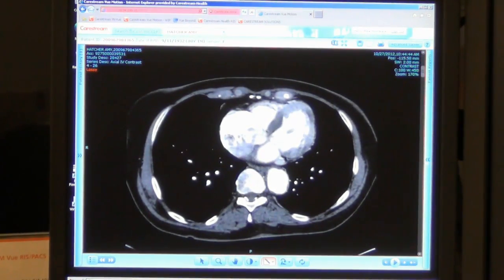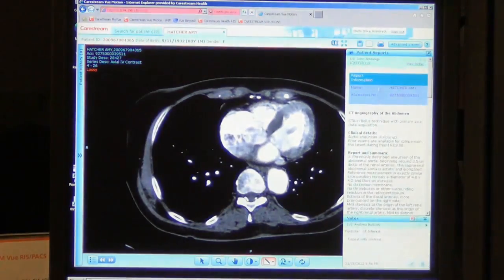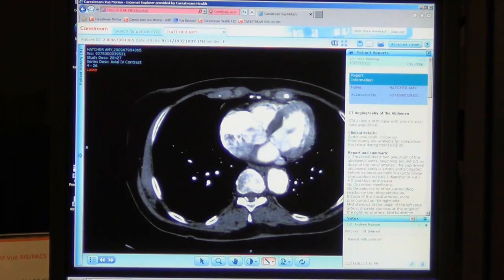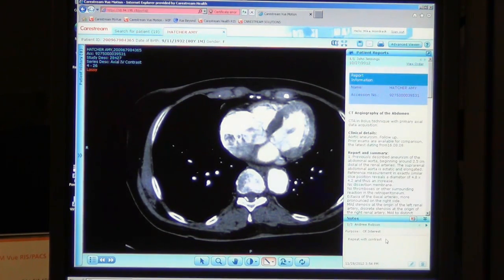To the right of my screen, I can pop out a panel that displays a text version of the report, along with any notes from the radiologist, which may include critical values.